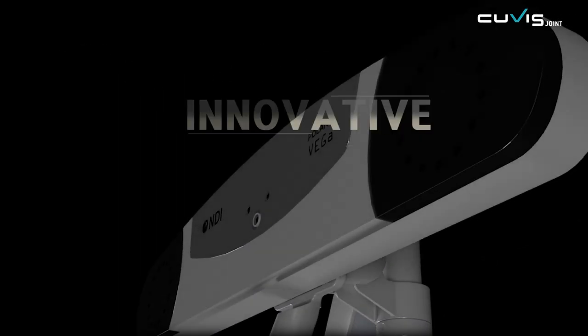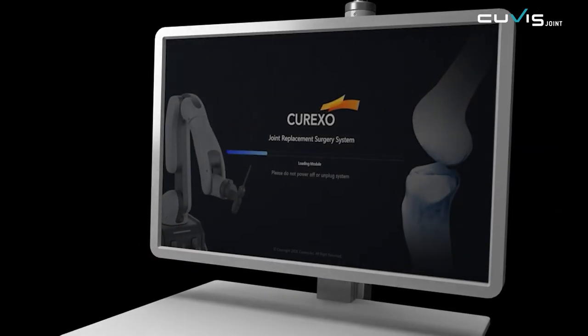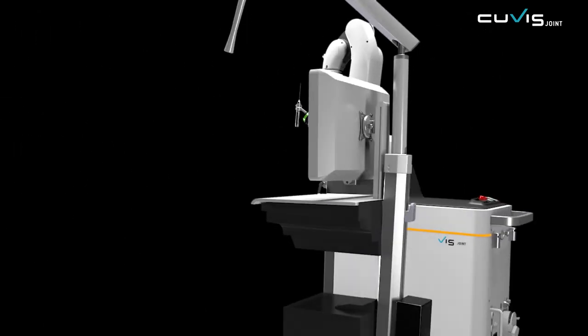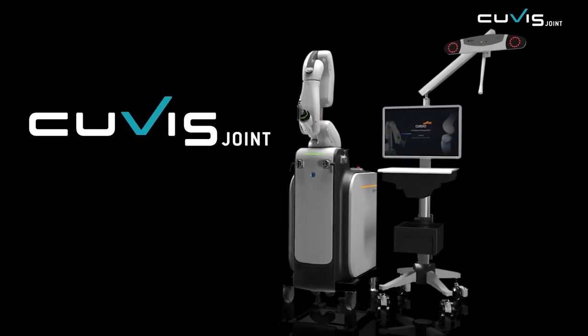Enabling accurate and safe surgery, accurate automatic cutting, and optimal surgical planning — CUVIS Joint will take your arthroplasty to the next level.